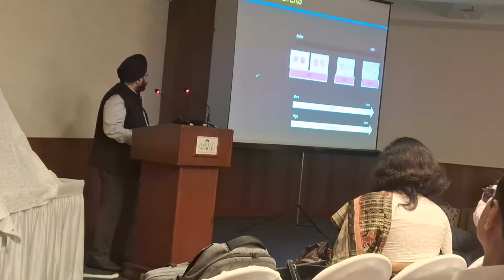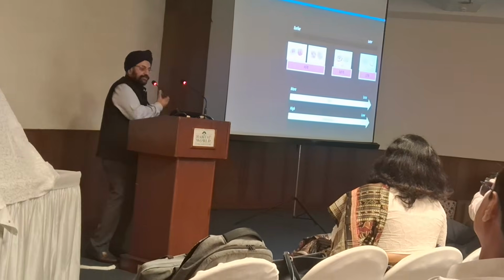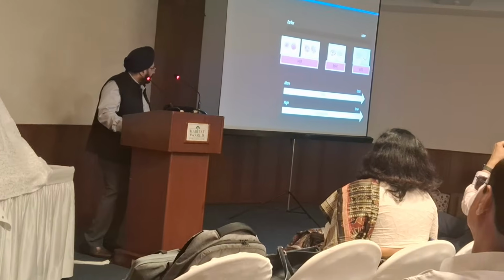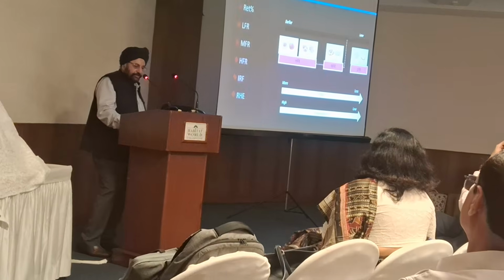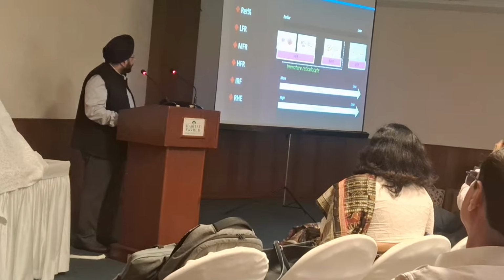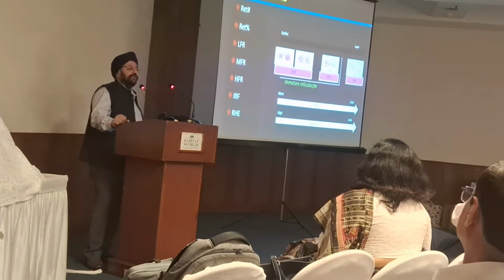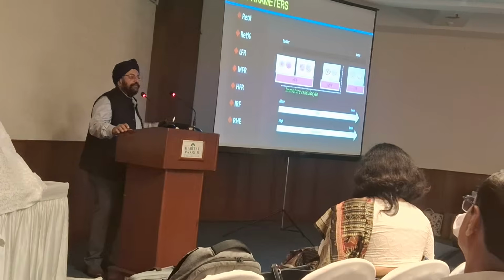So stage 1 and 2 together are called HFR or high fluorescence reticulocytes, since they are the most immature. Stage 3 is the MFR or the medium fluorescence reticulocytes, and stage 4 is the most mature reticulocyte or the low fluorescence reticulocyte. So stage 1, 2 and 3 together are called the immature reticulocyte fraction. This is also important. In untreated megaloblastic anemia, reticulocyte count will be normal, but your immature reticulocyte fraction will be high. That is going to give it away.